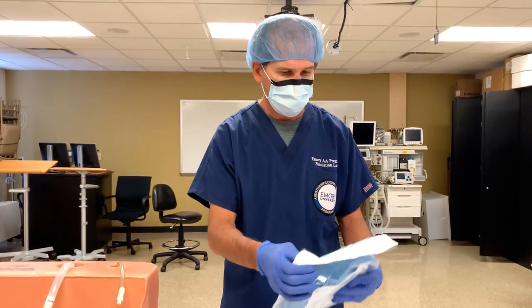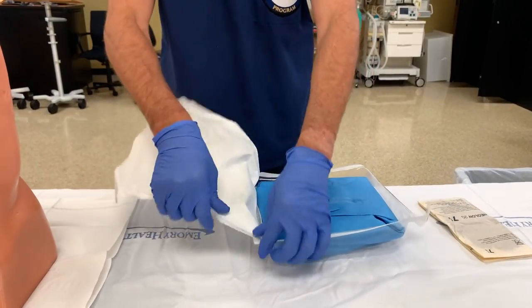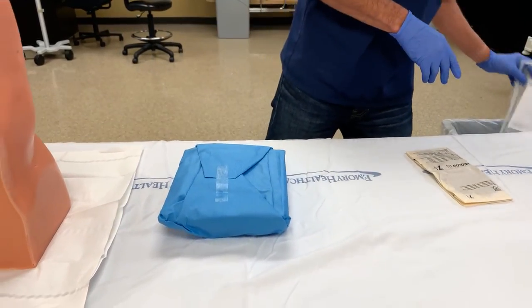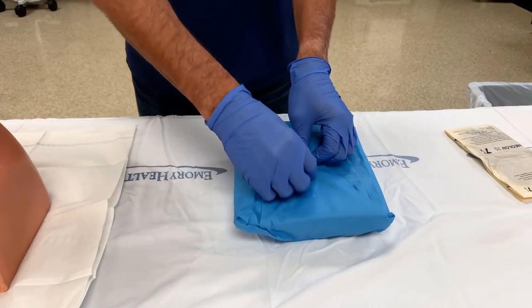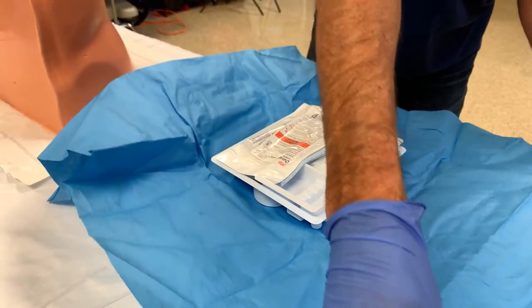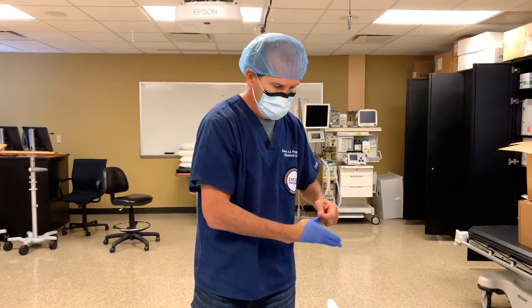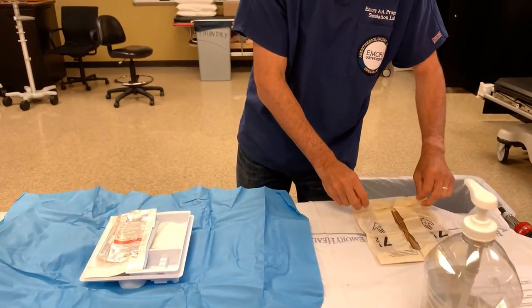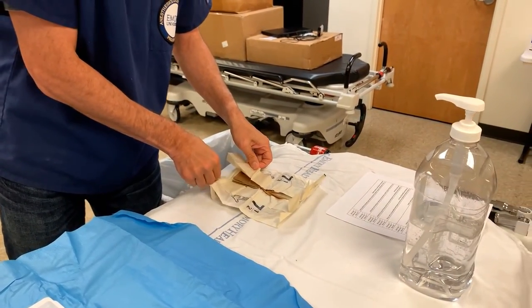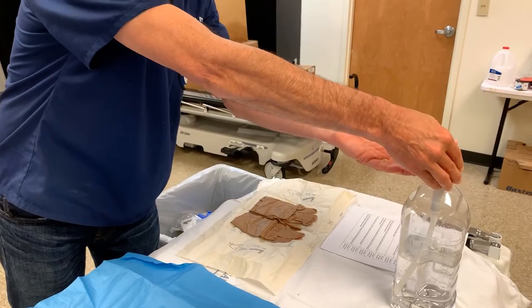We have our tray here that we're going to go ahead and open. We'll remove the inner packaging and get the tray itself opened up. Now we're ready to go ahead and get our sterile gloves on — we'll get those opened up and ready to go.